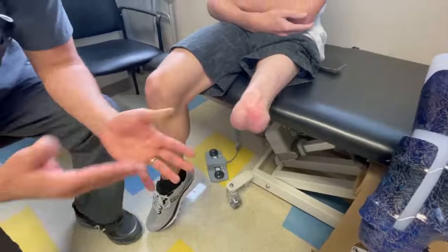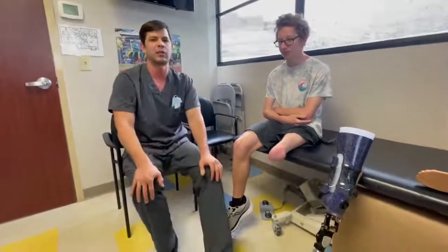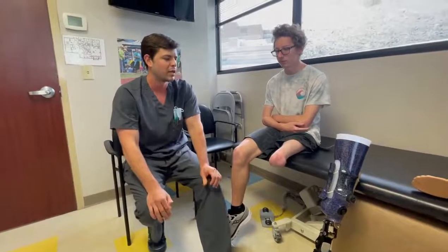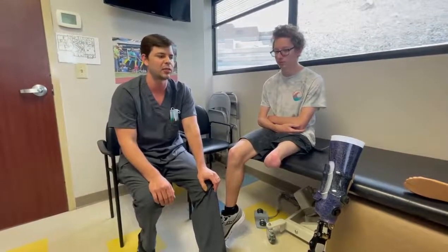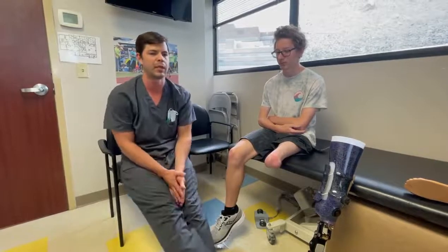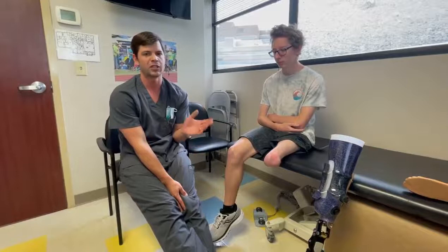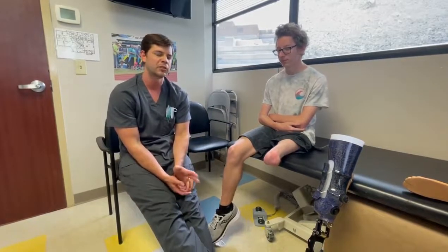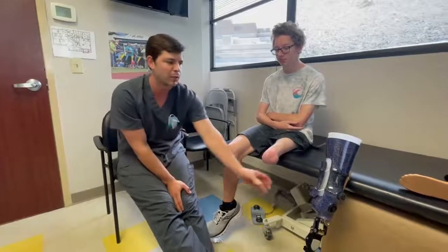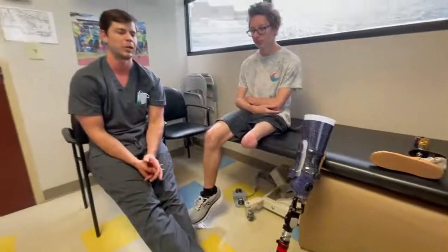It elicits some pain, so we try to promote removing the patella just to eliminate any variables that can cause pain and discomfort. Because he has his patella intact, we had to make some modifications to the socket to make it more bulletproof. When we first saw him again, coming out of a gel liner, we put him in a skin-fit suction socket combined with BOA panels for adjustability for when he loses volume and gets more active.